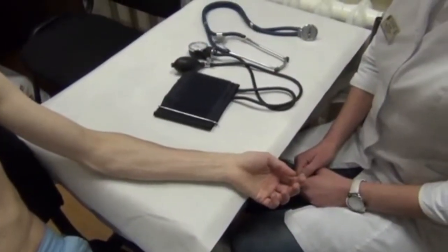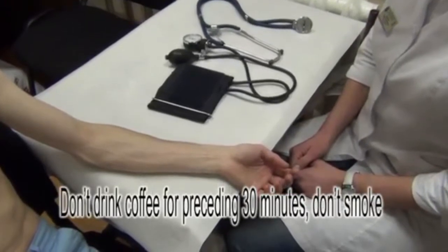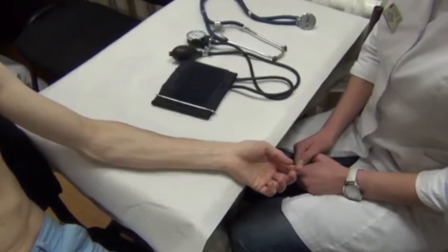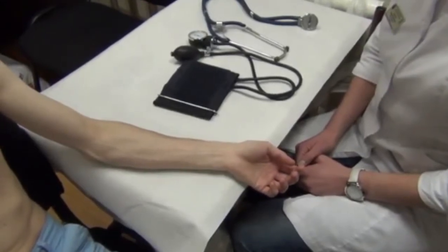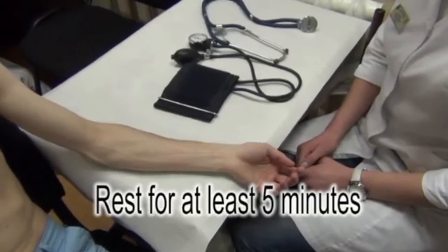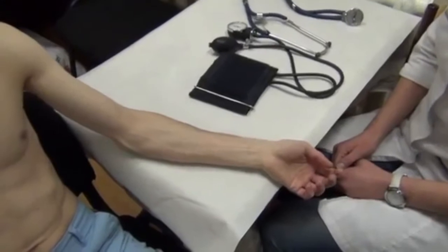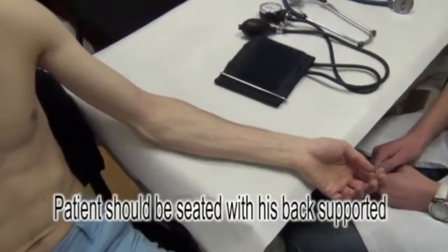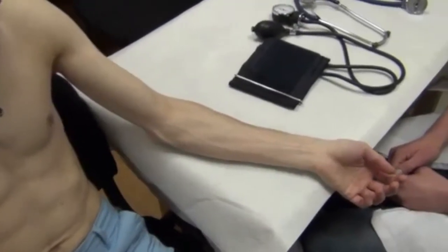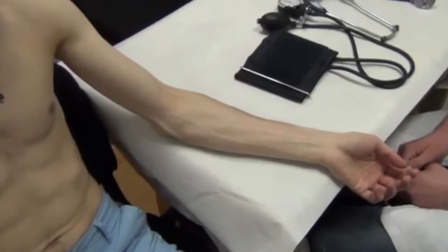Before the blood pressure measurement, a patient should avoid drinking coffee and smoking for at least 30 minutes. Blood pressure measurement is provided after at least 5 minutes of rest. The patient should be seated with their back supported, and the feet should be placed flat on the floor in parallel, not crisscrossed.